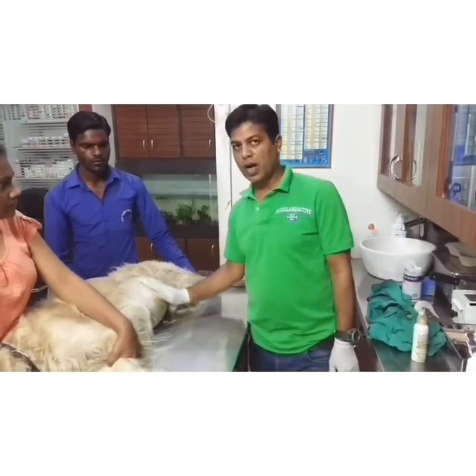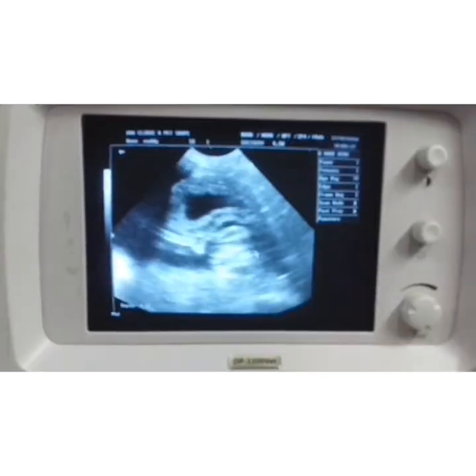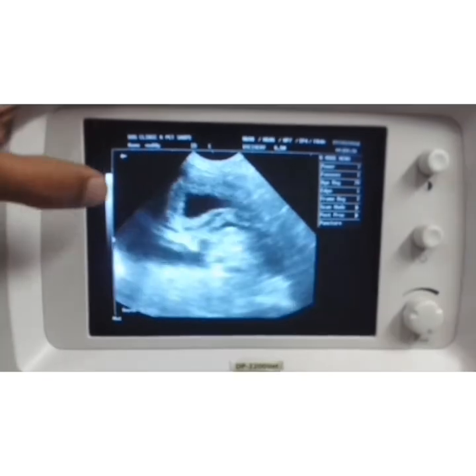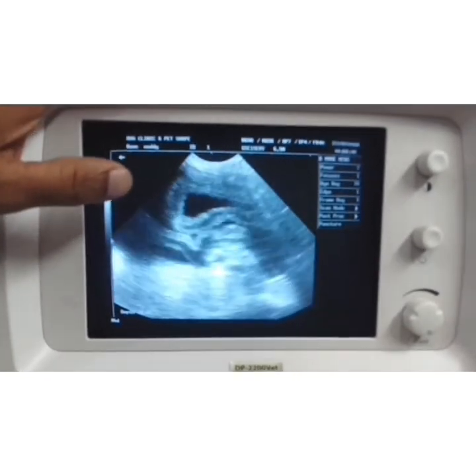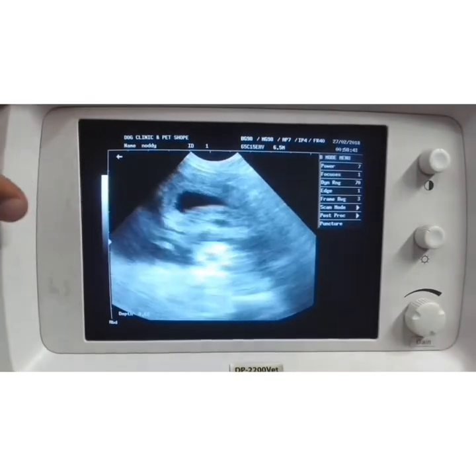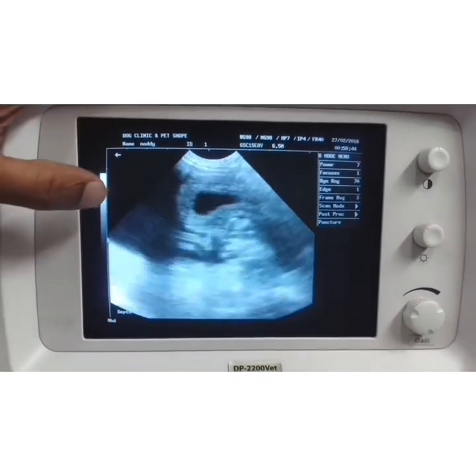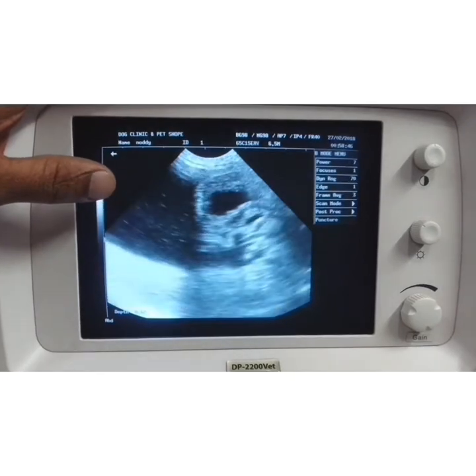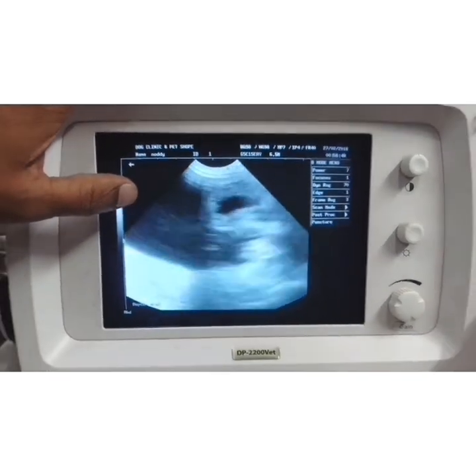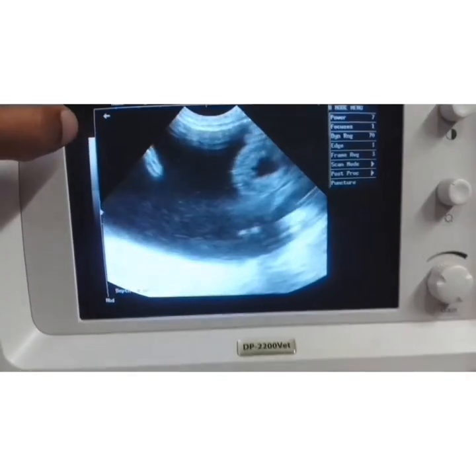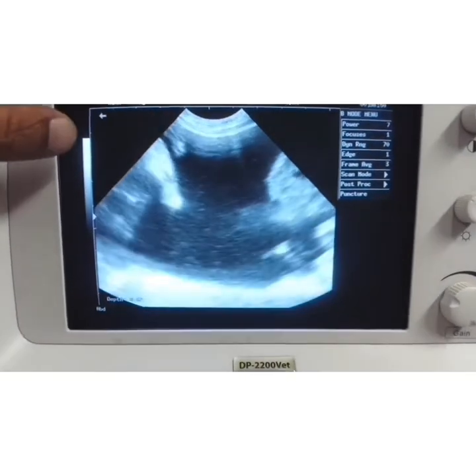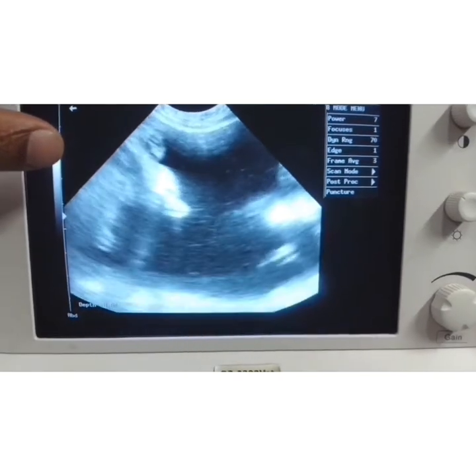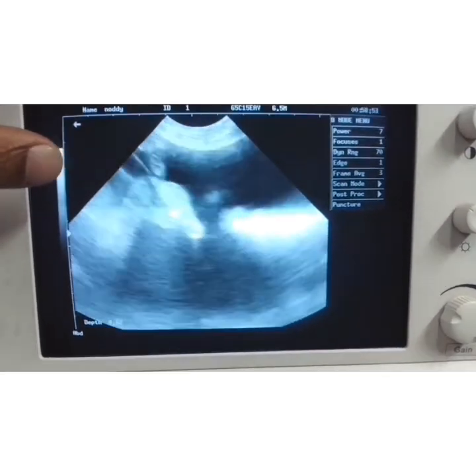Now I will do the sonography to assess the possibilities. This is the urinary bladder. By the side of the bladder, you can see the fluid — accumulation of fluids. These are the intestines which are floating here in the fluid.